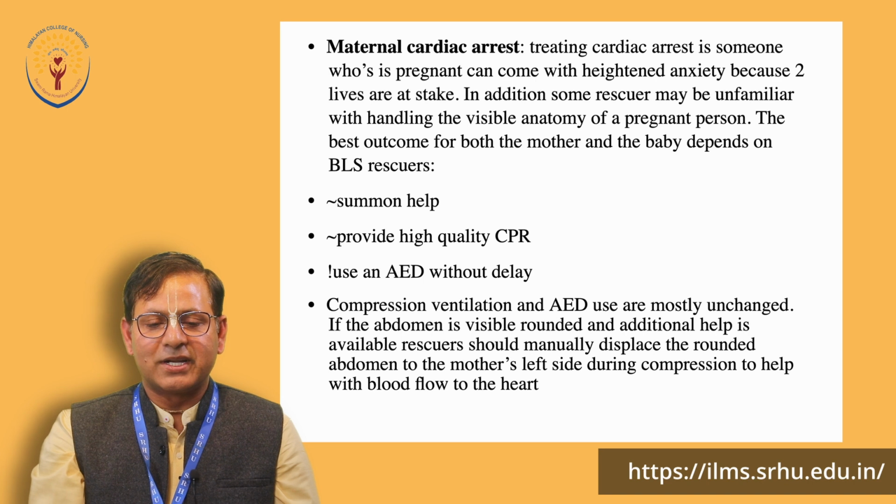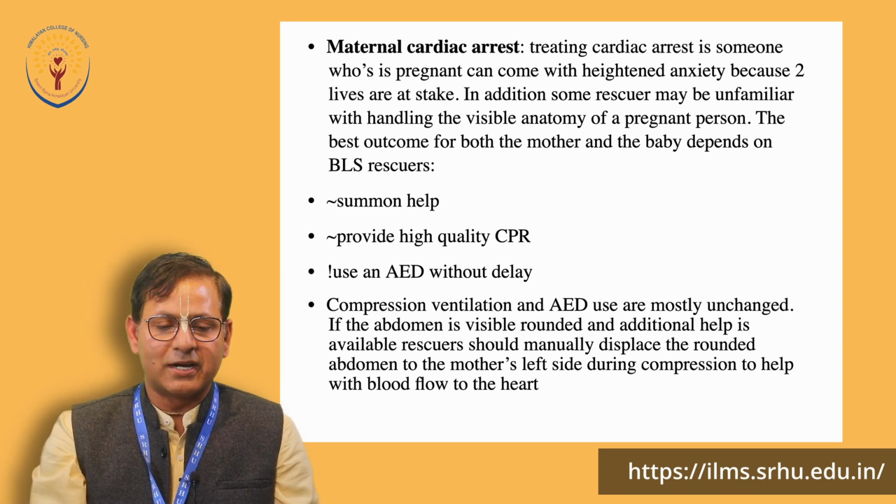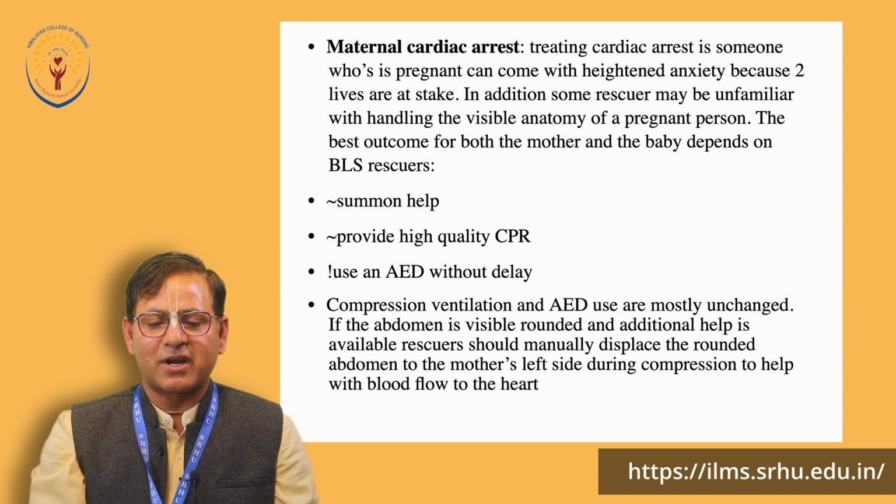So compressions, ventilation, and AED are usually mostly unchanged. It is the same as what we do for an adult. And if the abdomen is visibly rounded and additional help is available, the rescuer should manually displace the rounded abdomen to the mother's left side during compression to help with blood flow to the heart.